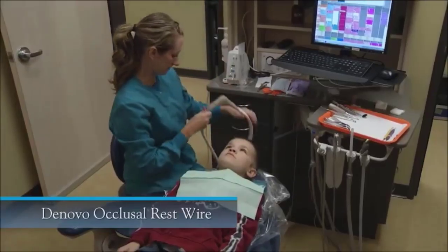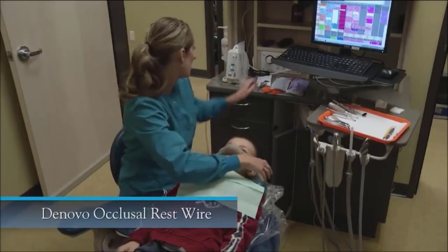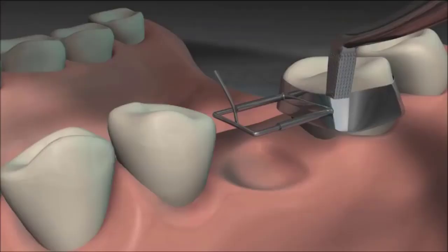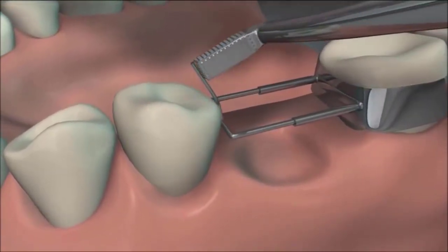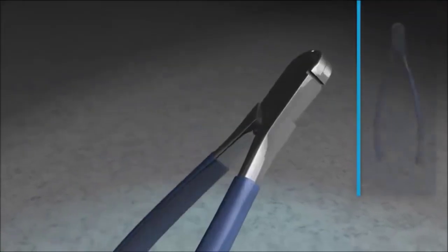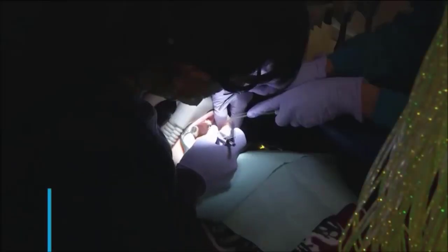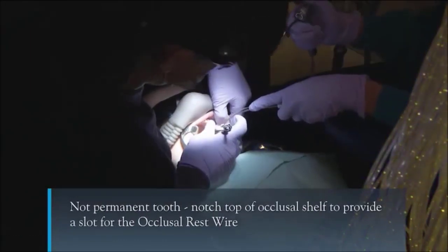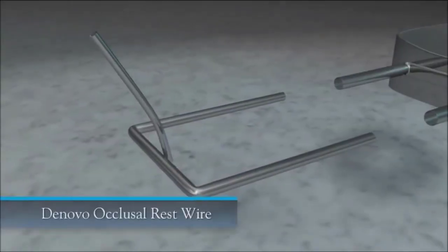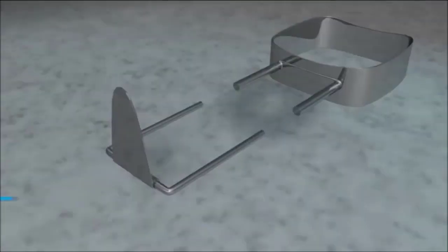Patients who chew gum, ice, or hard candy are ideal candidates for the occlusal rest wire, which holds up well to increased masticatory forces. The occlusal wire is manufactured with the occlusal rest going straight up. Once the band is seated, bend the malleable occlusal rest wire over the occlusal ridge using the De Novo band seater. If the wire is too long, cut it with the De Novo wire shear. The occlusal rest wire is made of a soft metal that provides a comfortable bite for the patient.